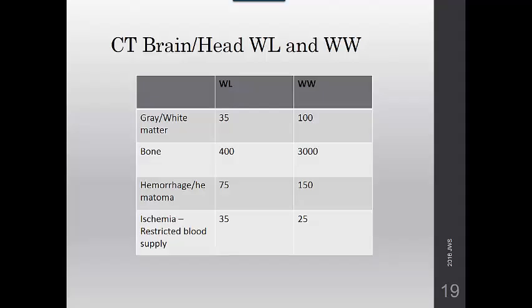The DFOV will be small, and the scan field of view will be head. Standard or soft tissue algorithms are used, and as you can see, the window width and the window level settings are subjective and vary from department to department. But these listed in this protocol are within the range and are acceptable.